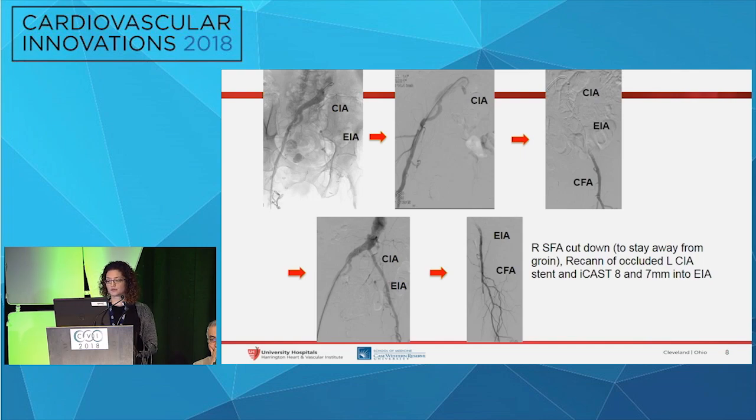And at this time, what was a little bit surprising to me, truthfully, because I had her left groin all prepped out, was that her disease was really not that significant at the common femoral artery level. It was likely a combination of a little bit of posterior plaque on the CT and an underperfused vessel on CTA. So from this point forward, we proceeded with balloon angioplasty and placed covered stents within the old stent, into the common iliac artery and the external iliac artery, and balloon dilated that to a good common femoral and good profunda.